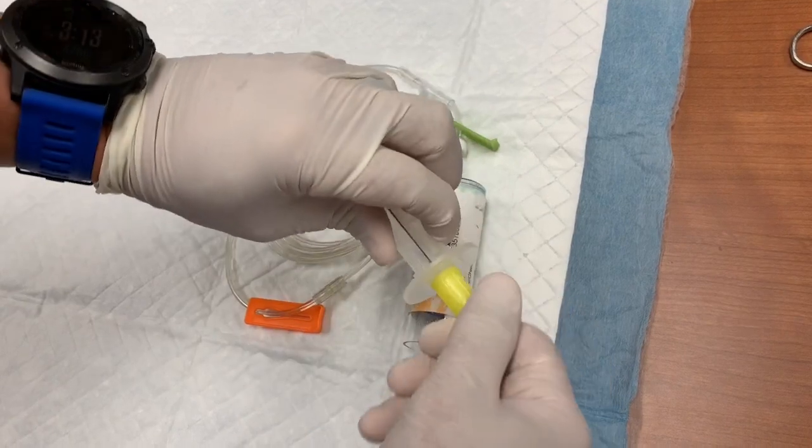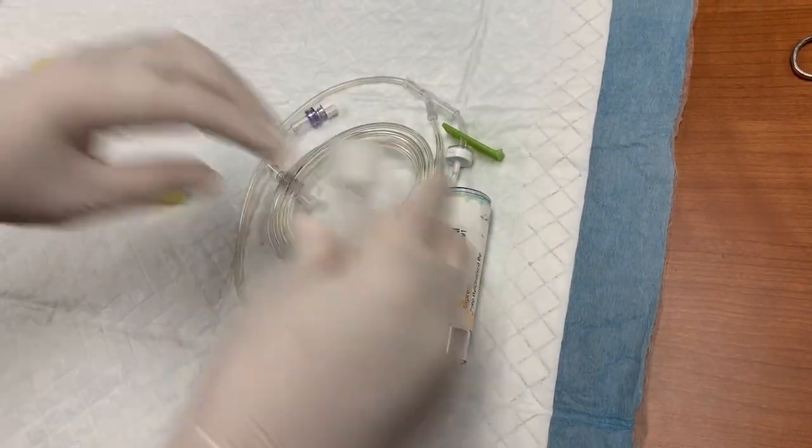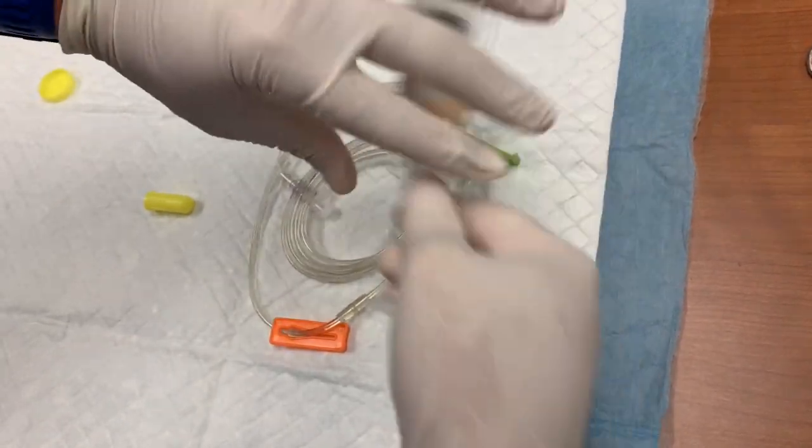First, open up your IV set and you'll find a plunger piece. Take that plunger piece and screw it onto your medication syringe. Once you have that finished you can set that aside for now — we won't need it yet.